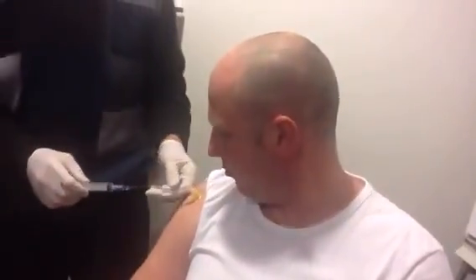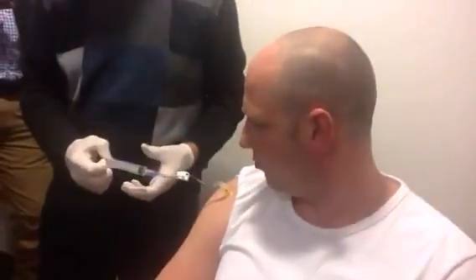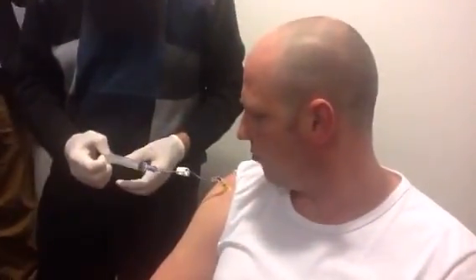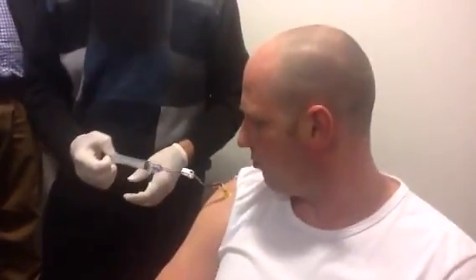Again, a little gentle pressure — you don't have to have a lot. You don't expect it to come out immediately; just a little negative pressure, count to ten, and usually you'll see something come out. Okay. Nice, rich blood.